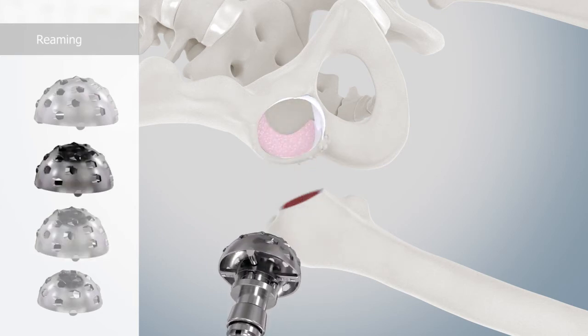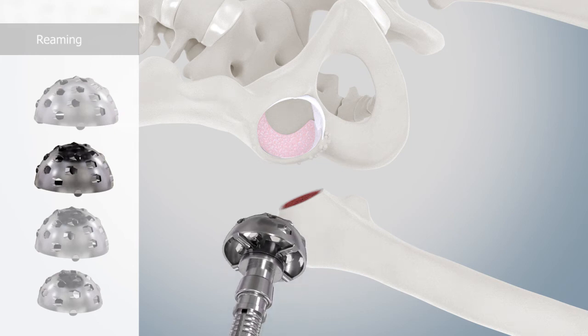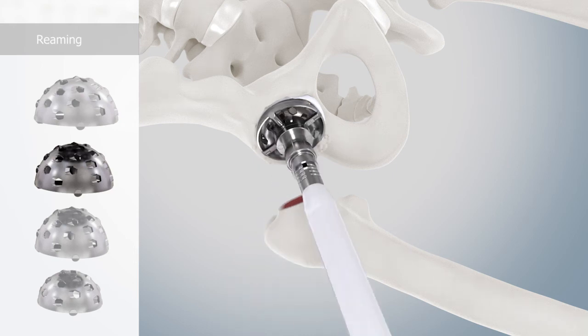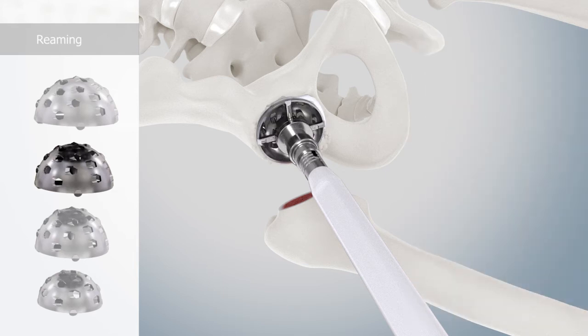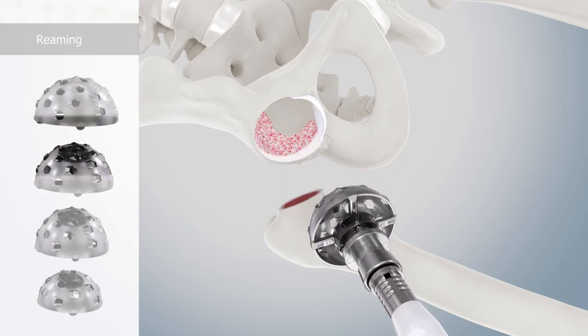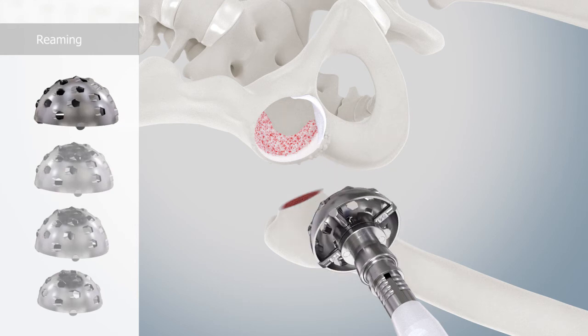With the last or penultimate reamer diameter before the preoperatively planned target size is reached, the reaming direction is then finalized in the desired inclination and anteversion until minor bleeding of the subchondral bone is visible. Care should be taken to prepare the acetabulum as precisely hemispherical as possible. Development of an oval shape, e.g. due to unsteady reaming by the operating surgeon, can impair the implant fit.